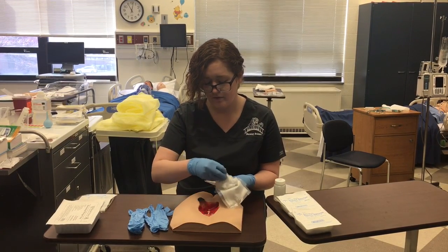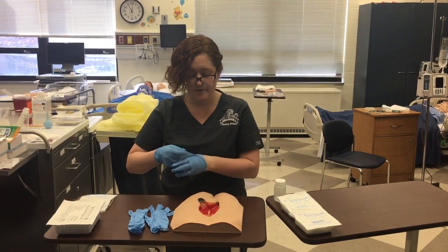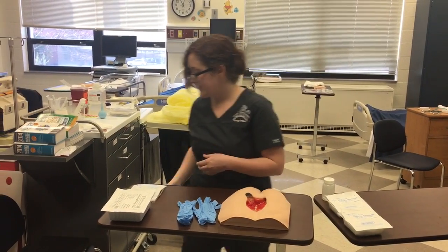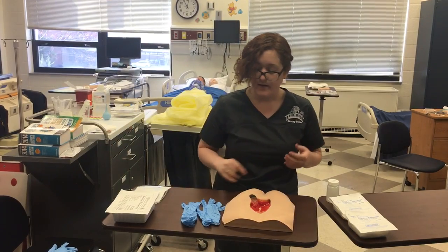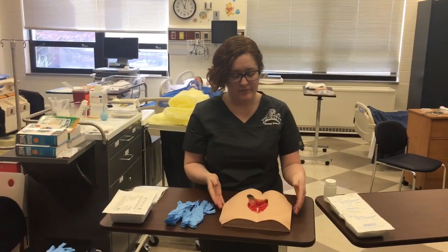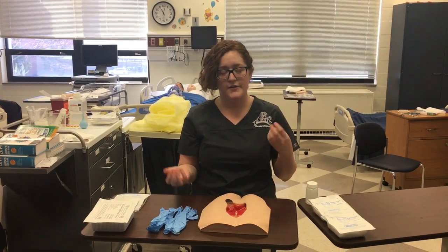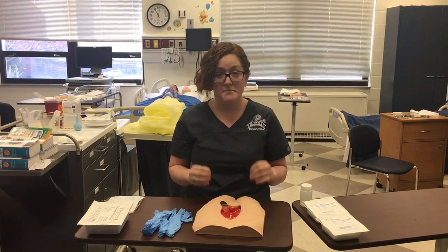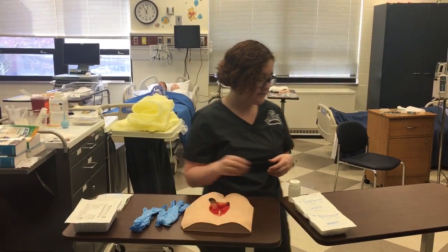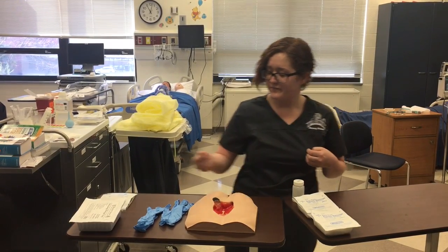There we go. Alright, then I'm gonna wrap this up inside my glove and dispose of it in a biohazard container. Then I'm going to assess the wound for the drainage, the type of exudate and the odor, and the amount. I'm going to perform hand hygiene, and then I'm going to set up my sterile field.